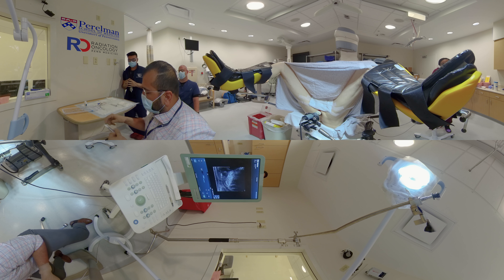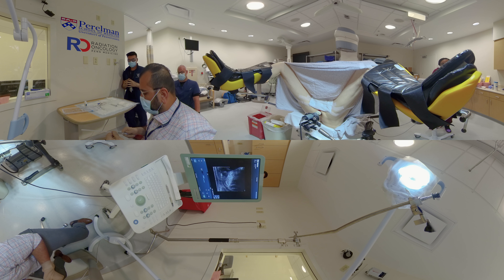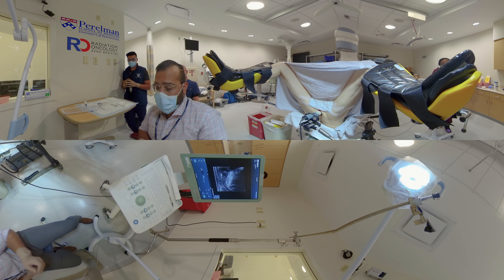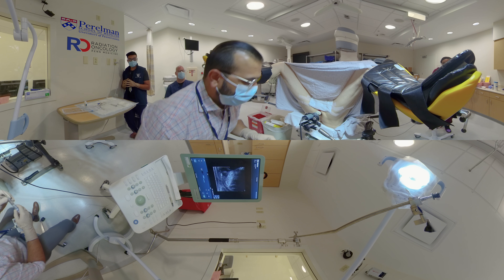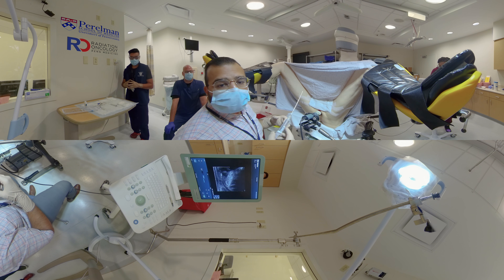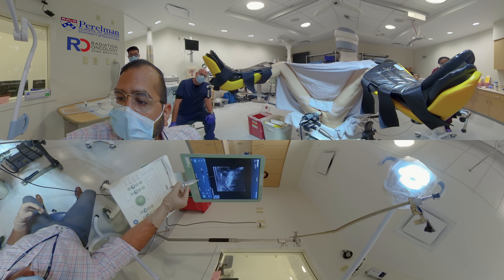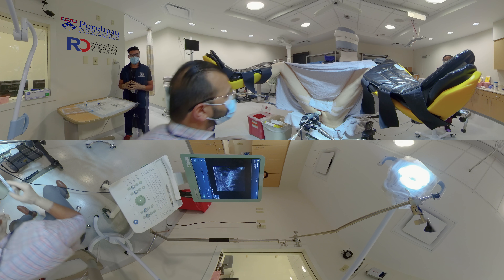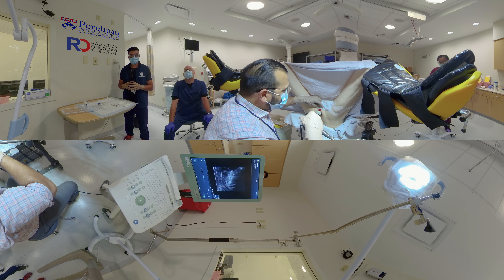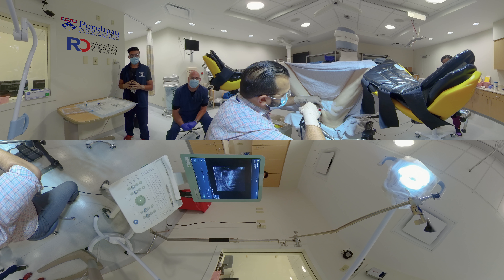Remove the hydrodissection needle from the tray and attach a 10 cc saline flush. Expel any air to prime the needle. Turning back to the patient, remember what position your bevel is in. Insert the needle always with the bevel down, and you will have the bevel down for the rest of the procedure. Here is the landing pathway for the hydrodissection: you aim to enter anterior to the rectal hump and then angle your needle posteriorly to enter the retroprostatic fat. Always remember to have your bevel pointing down for the remainder of the procedure.